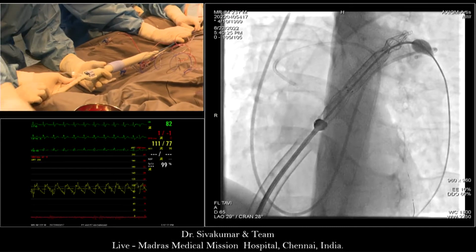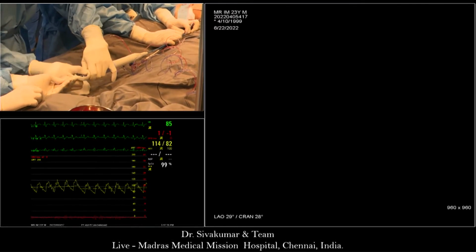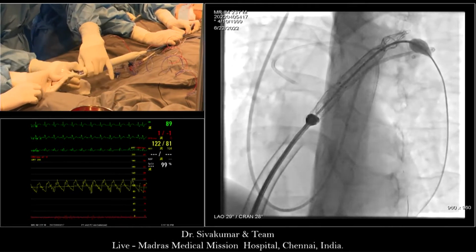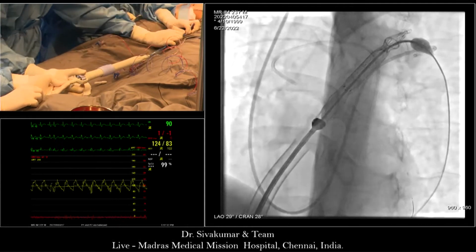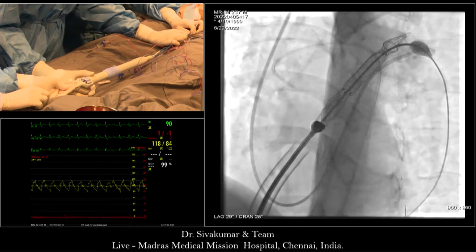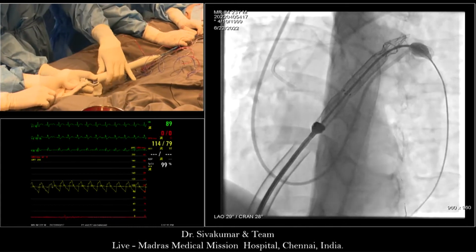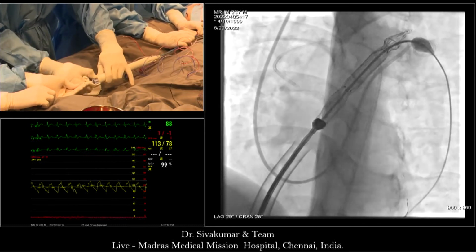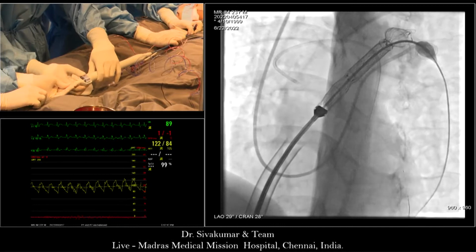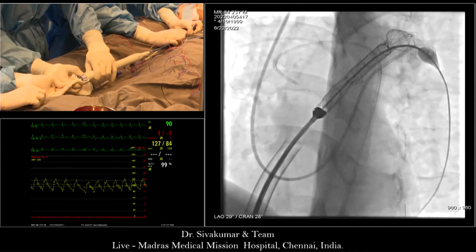It's a little tighter. This screw is much tighter. Now, slightly pull out, Venkatesh, the pigtail, marginally. It may flip because it is the jugular axis, or else leave it there. At present, leave it there. If it completely comes out, then I will be finding it difficult to re-enter.